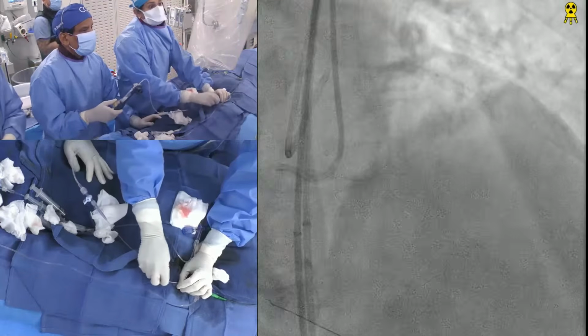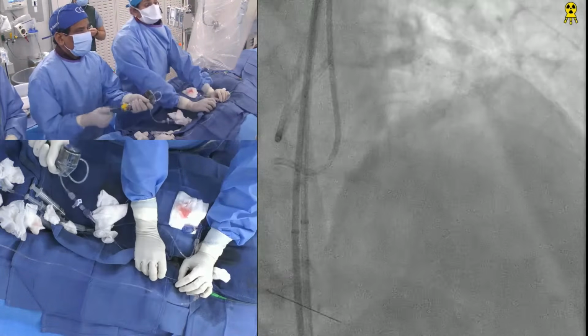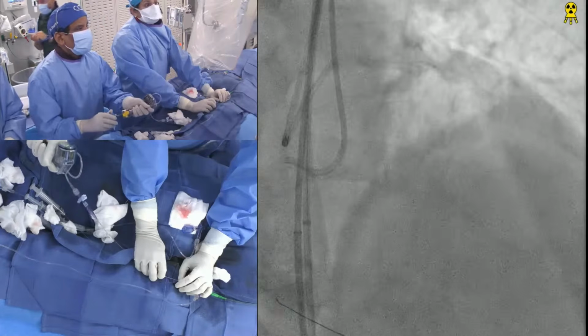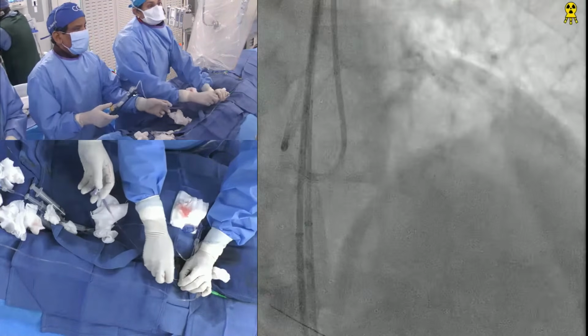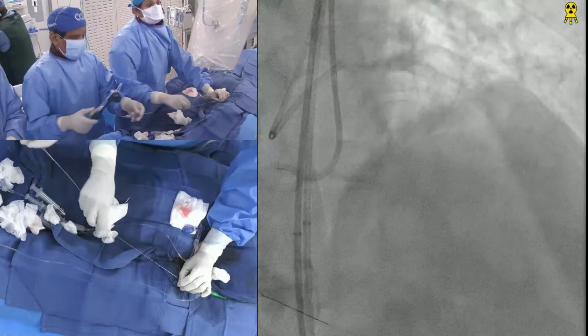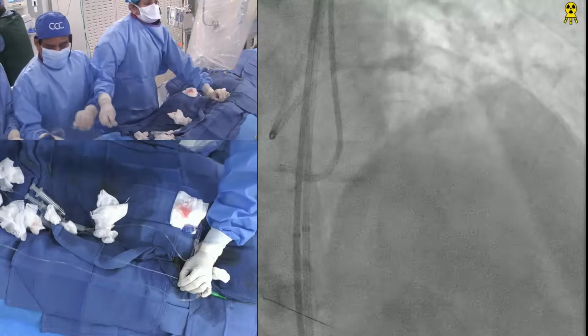Maybe this balloon wire doesn't have a good body. Yeah, the wire went in, but there's no body. Okay, good. One more try. Okay, good. Get the gold quickly. All right, let's get the gold.